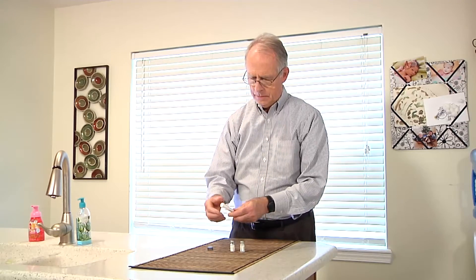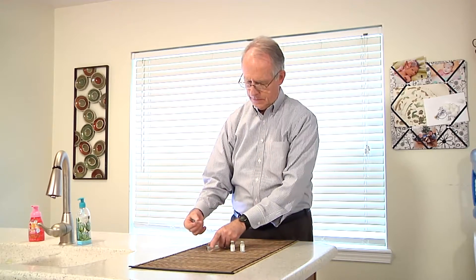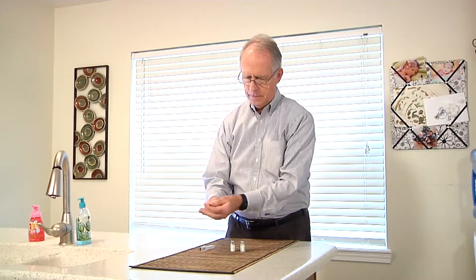First, twist the cap off the syringe's protective case, remove the syringe, and remove the protective cover from the needle.